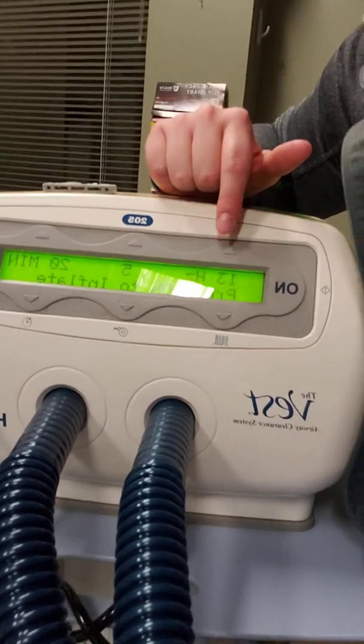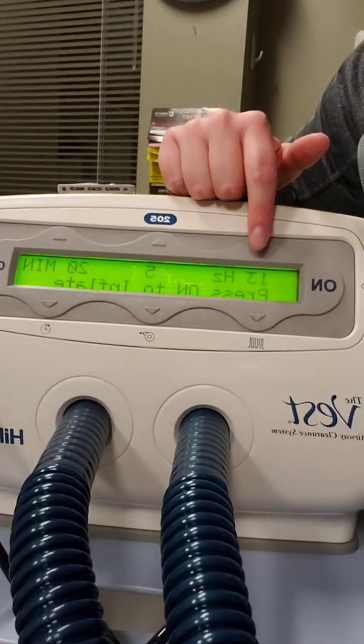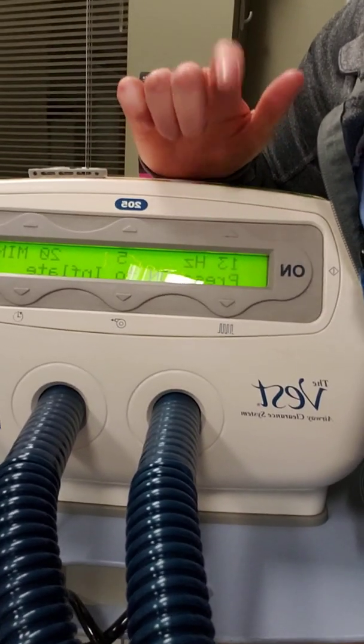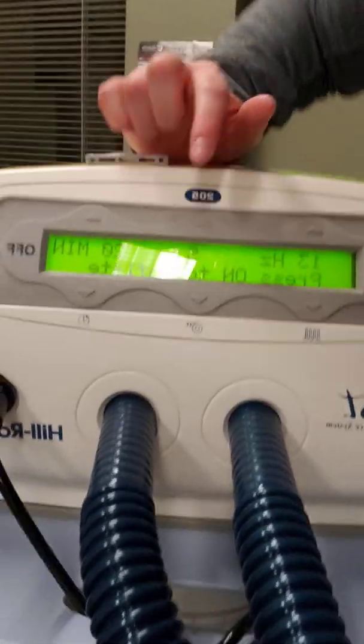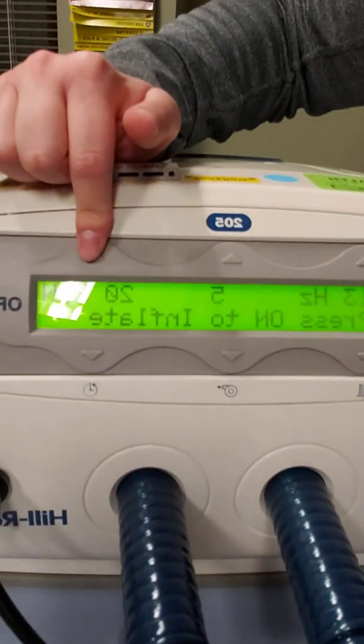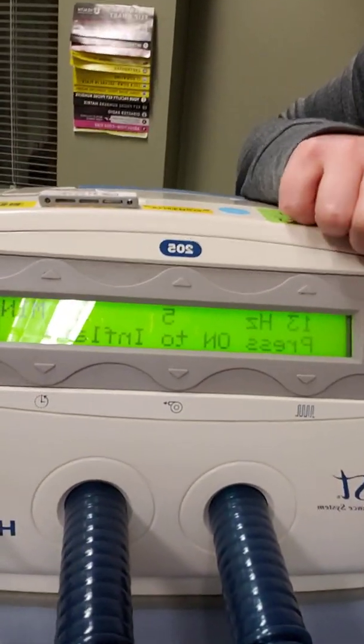And we can see the hertz, which is the frequency. So it will oscillate 13 hertz, so 13 times 60. And then the amplitude, or how aggressive it is, and then the length of time. So you press on to inflate.